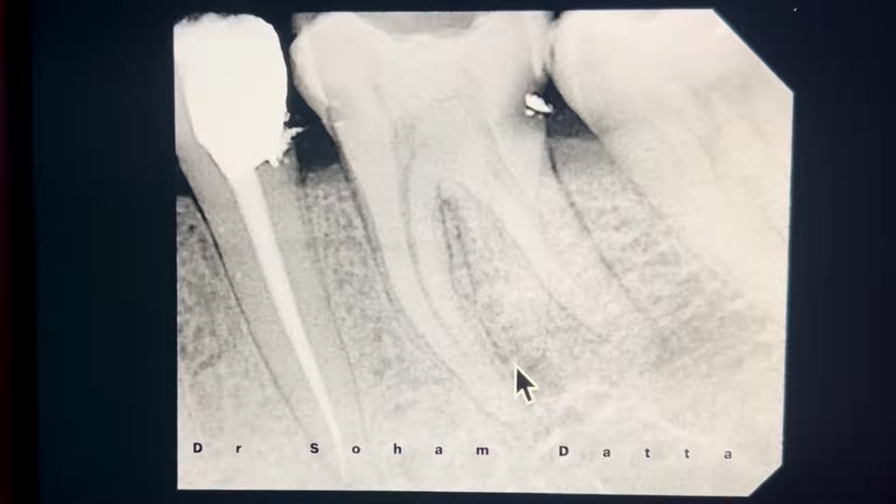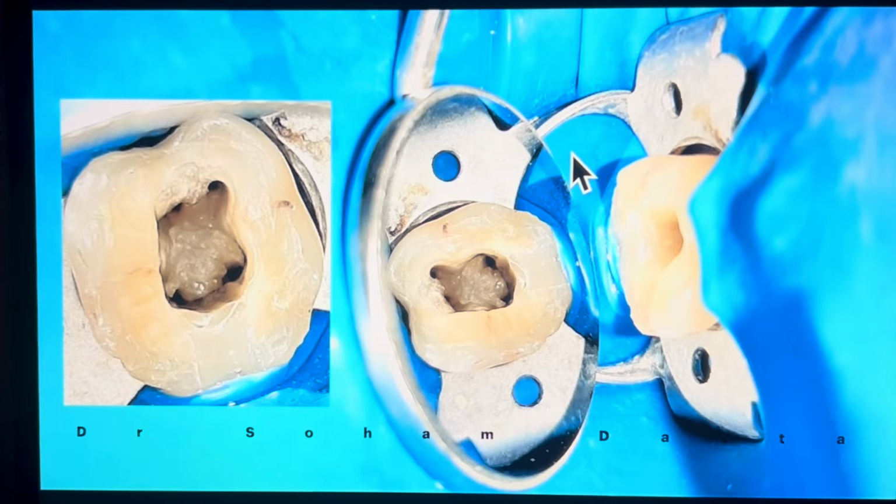That is mostly a distolingual root. So it's a case of a Radix entomolaris because it is present on the distal side. Now this is the access cavity of that tooth. This is the mesiobuccal orifice. This is the distobuccal. This is the distolingual. This is the mesiolingual. This is the pre-endodontic buildup after removal of the caries by composite.